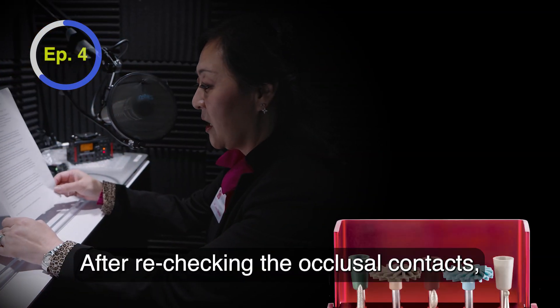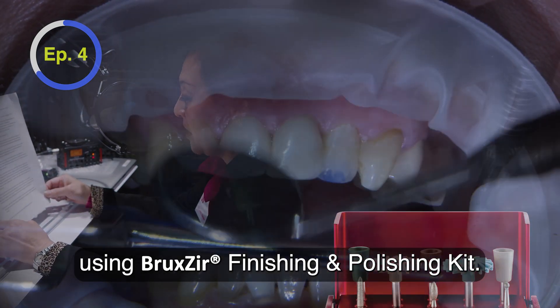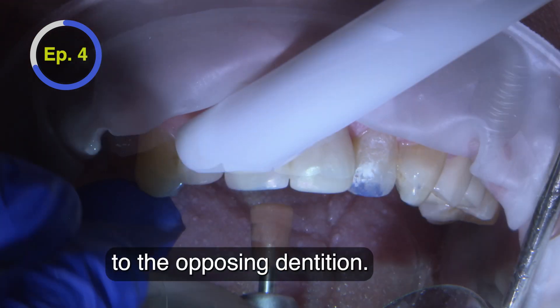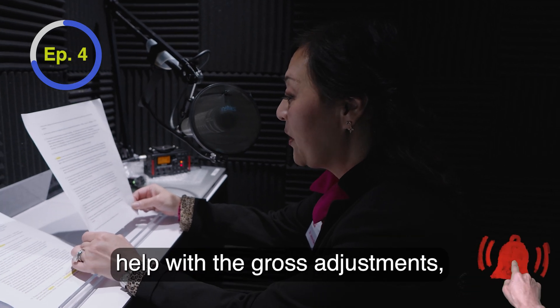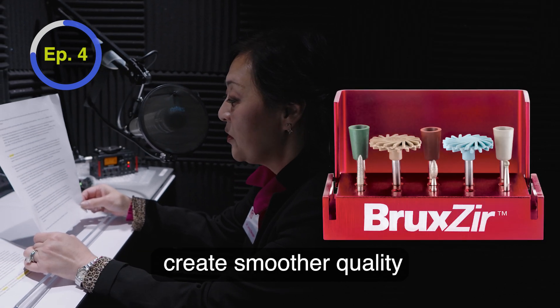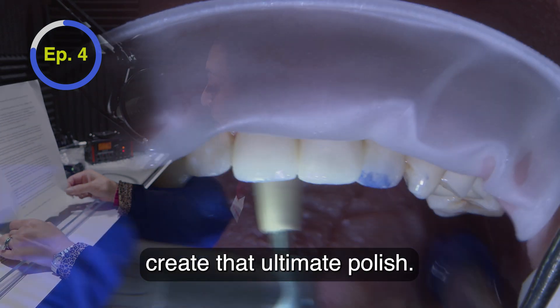After rechecking the occlusal contacts, any further adjustments are made using the Bruxer Finishing and Polishing Kit. It has everything needed to regain a smooth, shiny surface that's kind to the opposing dentition. The red-striped diamond burrs help with gross adjustments. Then, finishing cups — green, brown to white — are used to create smoother quality, ending with wheels to create the ultimate polish.